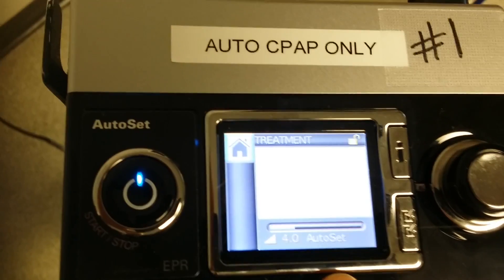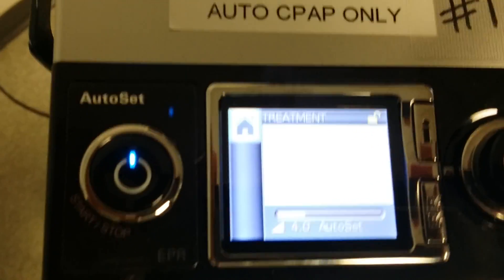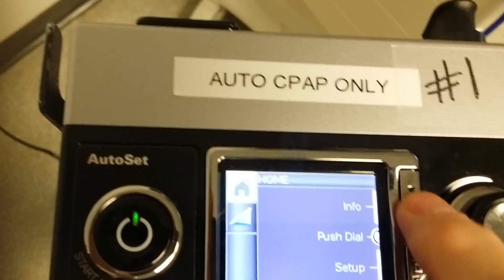It'll start detecting when you put it on the patient. Then the next morning, or when they're off of it, all that information will be available to look at under the info button.